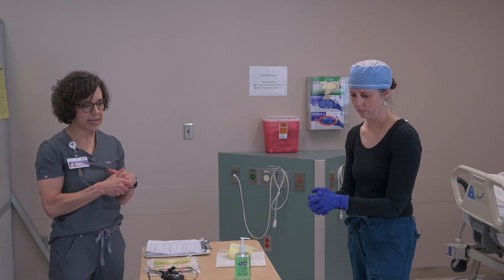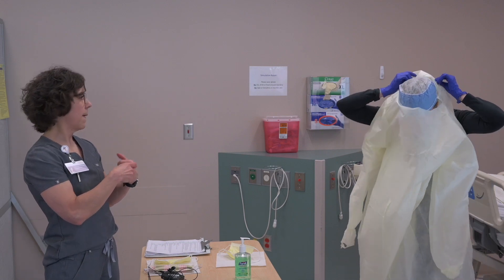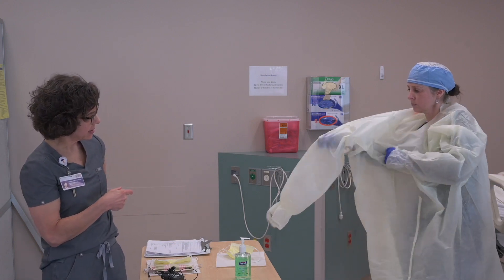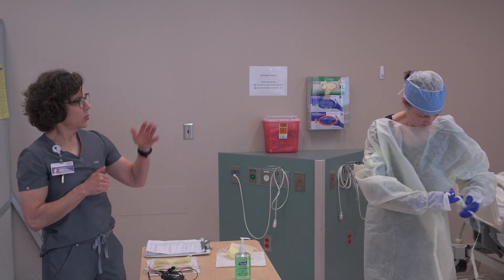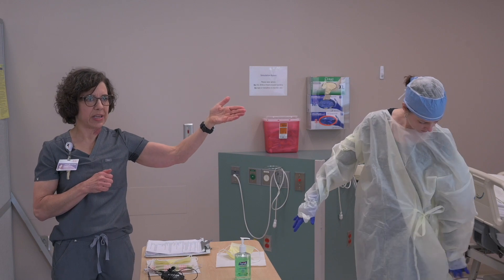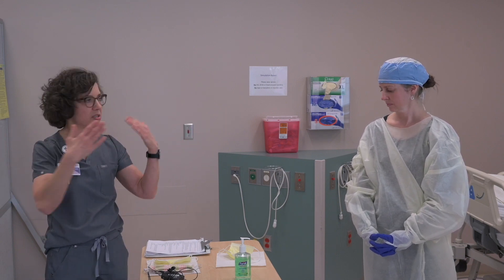Brooke, go ahead and perform hand hygiene and then don your first pair of gloves. Now Brooke's going to don her isolation gown — this is what's known as a level two isolation gown. She'll put that over her head and then we always tie it in the back. I also want to point out Brooke is wearing a surgical cap, which is simply to keep her hair out of her face and keep her from wanting to reach up and touch her face at any point.